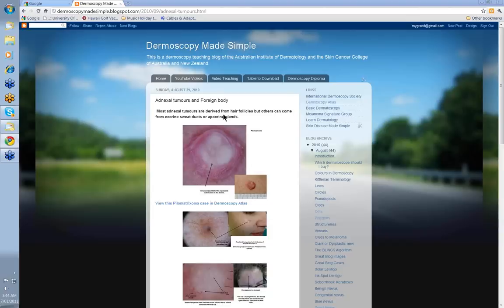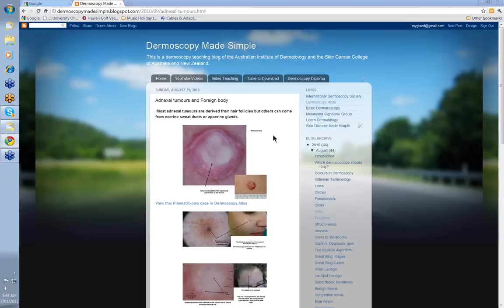Most adnexal tumours are derived from hair follicles, but others can come from eccrine sweat ducts or apocrine glands. Usually you think about adnexal tumours in three circumstances: first, if you've got white structureless; second, if you've got blue structureless or blue-white structureless; and third, if you've got vessels as serpentine lines branched. These are the three circumstances where you'll think about adnexal tumours, because they'll pick up the common stuff.